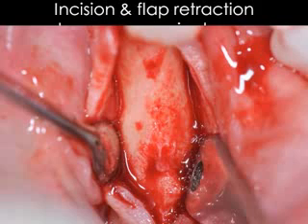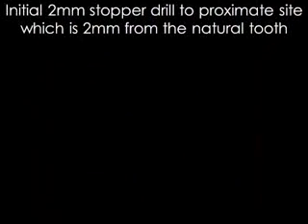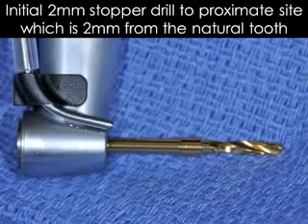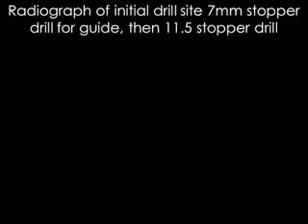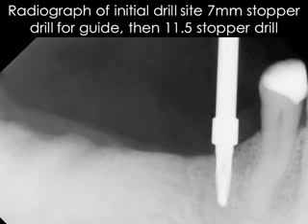Here we show the incision and flap of the particular area where we're going to be utilizing these implants. You can see clearly the nice ridge. We've already debrided the area of granulation tissue. And now we're going to be initializing our drilling process. I like to utilize the 7 millimeter stopper drill first, then take a digital x-ray to have a really nice marker of the area. Your 7 millimeter drill is not going to be compromising any anatomical structures, so we can utilize a 7 millimeter stopper drill first, take an x-ray, and then proceed from there.